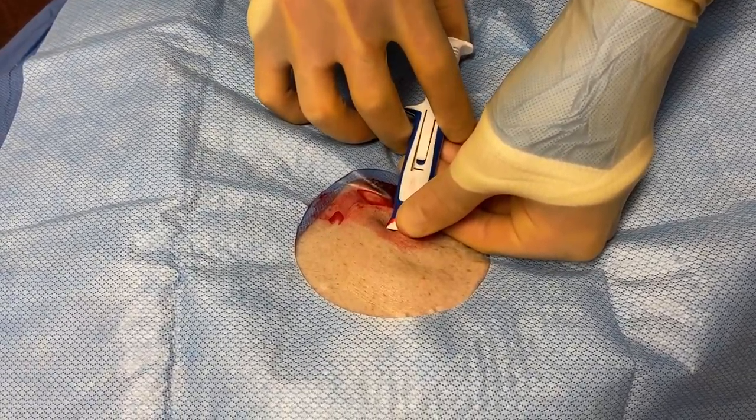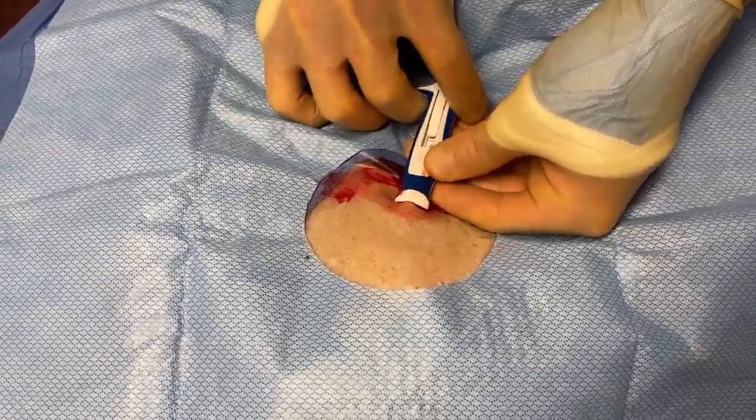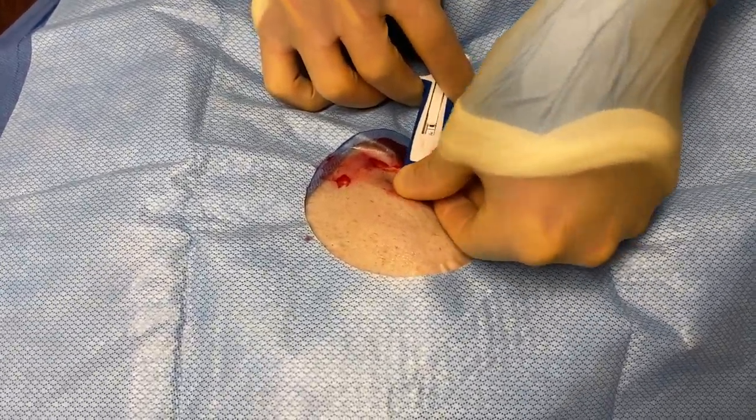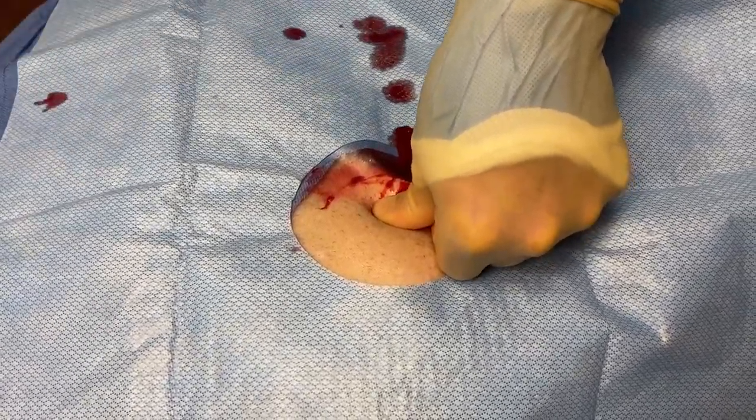I'm maintaining forward pressure and completely injecting that loop recorder subcutaneously. Succeeding in that, I can remove the insertion tool.